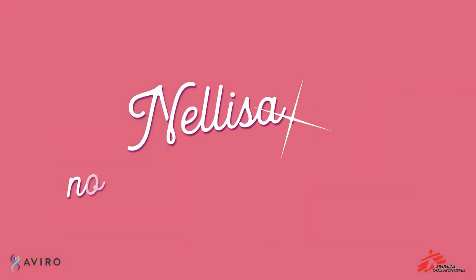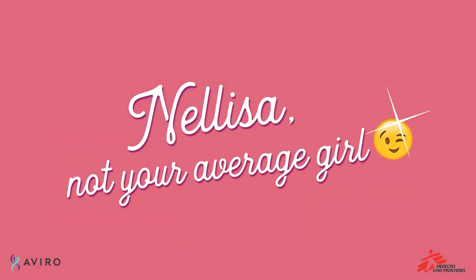Hey ladies, Nellisa, not your average girl here, and today I'm going to show you how to use the female condom. Now Nellisa knows that sometimes a girl needs to get down, but I also know how to stay safe. So me and my plastic vagina here are going to show you exactly how it's done.